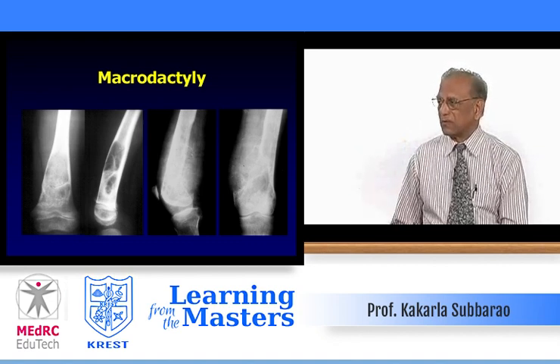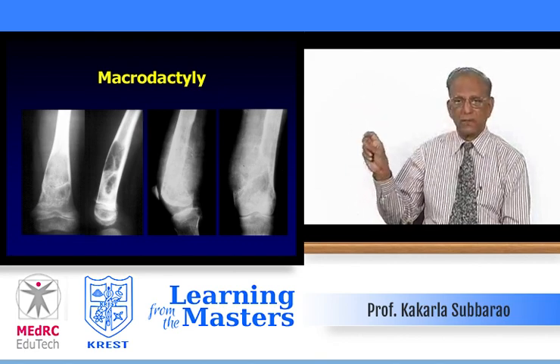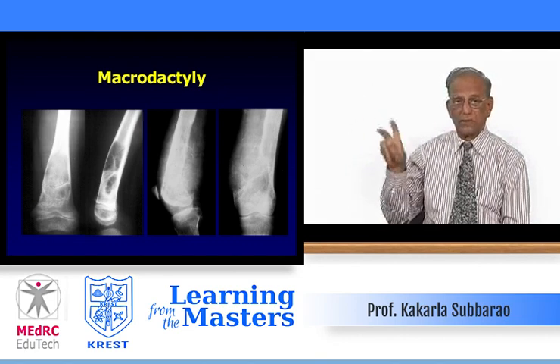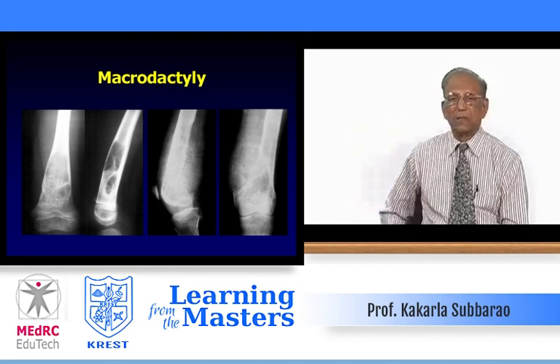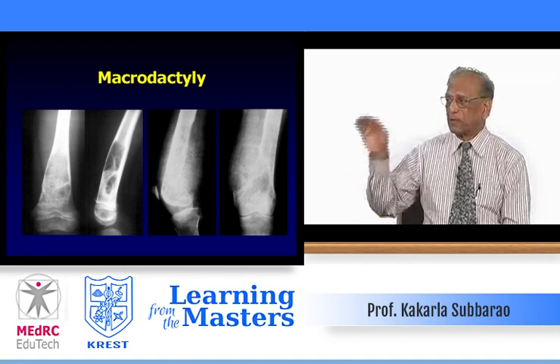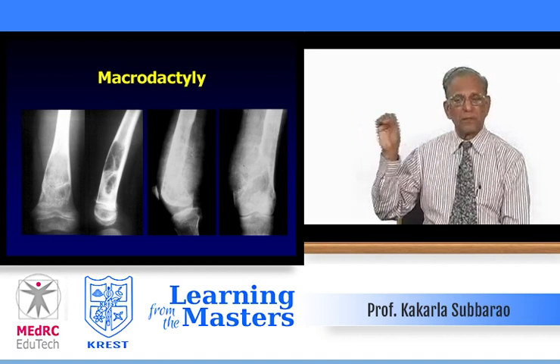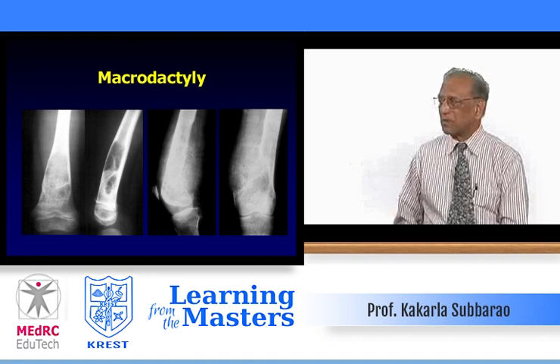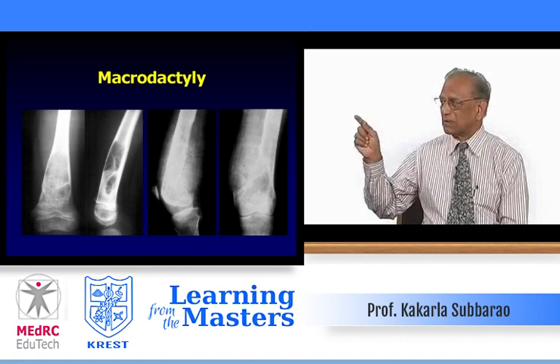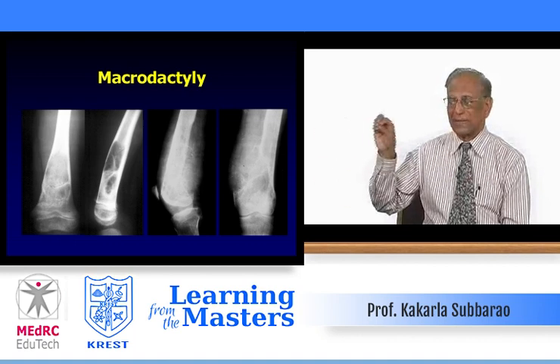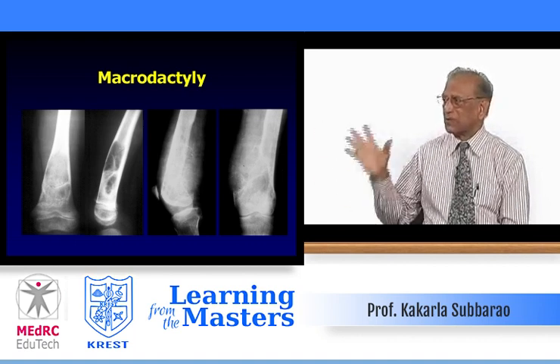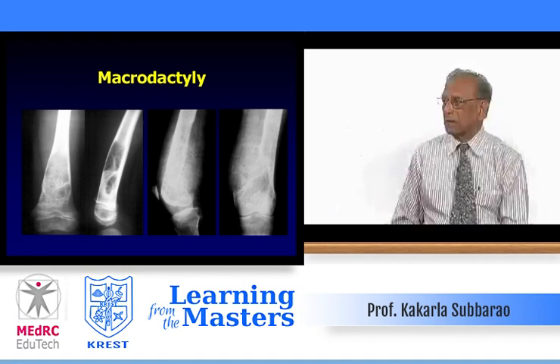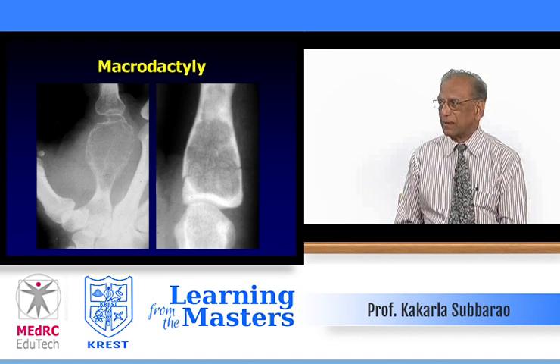Two lower ends of thighs — on the left side, a child with epiphyses not closed. You see elongation of a lucent lesion and horizontal expansion but not much vertical elongation, with thinning of the cortex. This is typical of a simple bone cyst or unicameral bone cyst. The thin transitional zone indicates it is benign. On the right side, an expanding elliptical lesion with broken cortex and a thin transitional zone — this is a brown tumor.